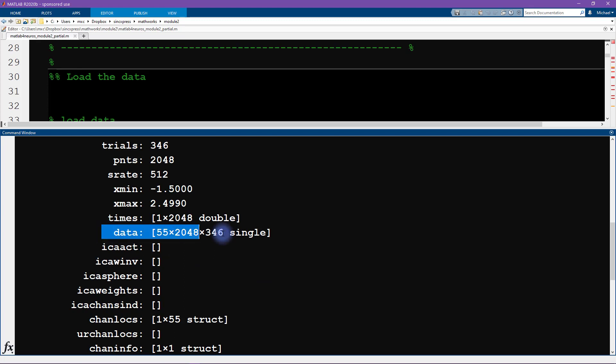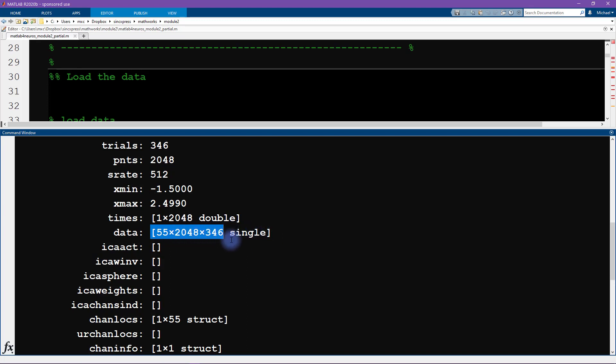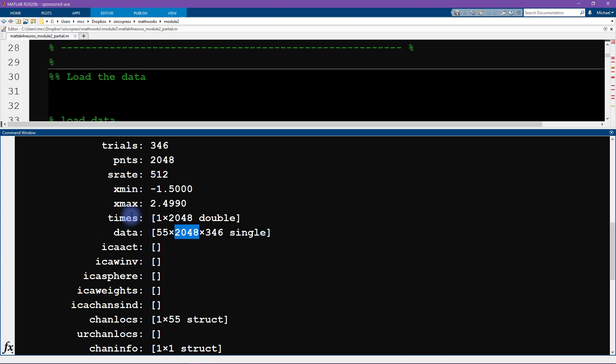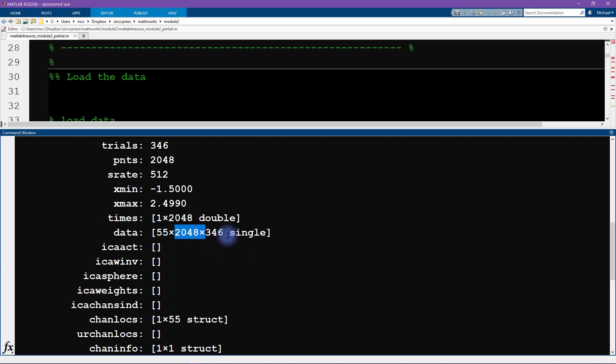One of them is EEG.data. You can see it's a three-dimensional matrix, so it's a cube of numbers. This corresponds to 55 channels, 2048 time points. You can see there's another field in here called times, EEG.times, which has all of the time points in milliseconds. So 2000 time points, 346 trials or stimulus repetitions.